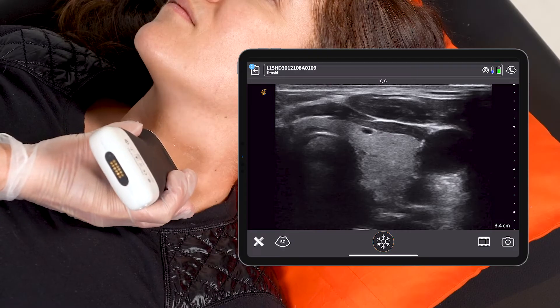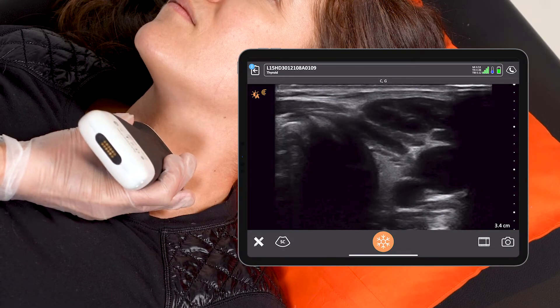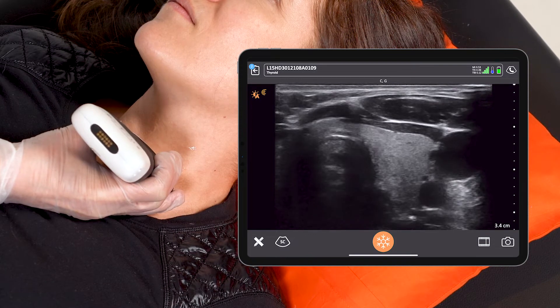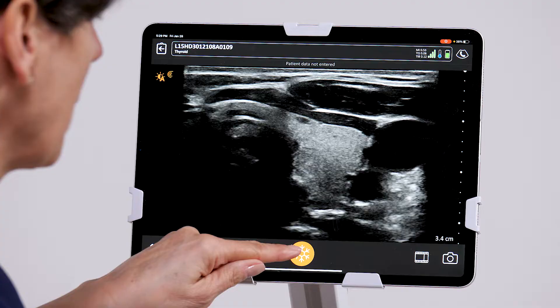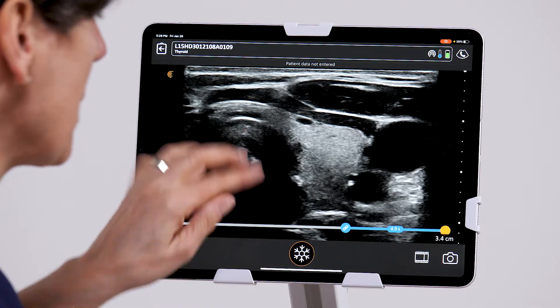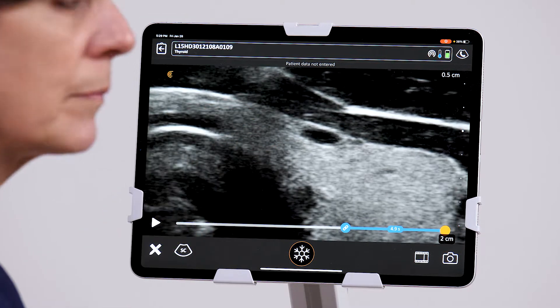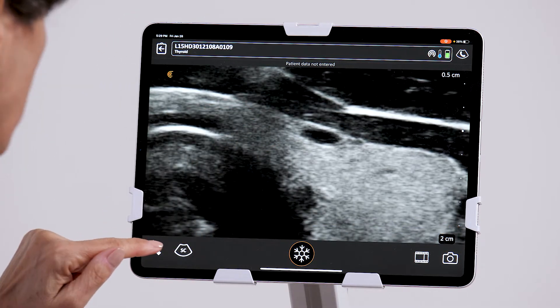When scanning the thyroid gland, if you encounter a nodule like I do right here, I'm going to freeze the image and zoom it up, and then I'm going to go into the measurement package.